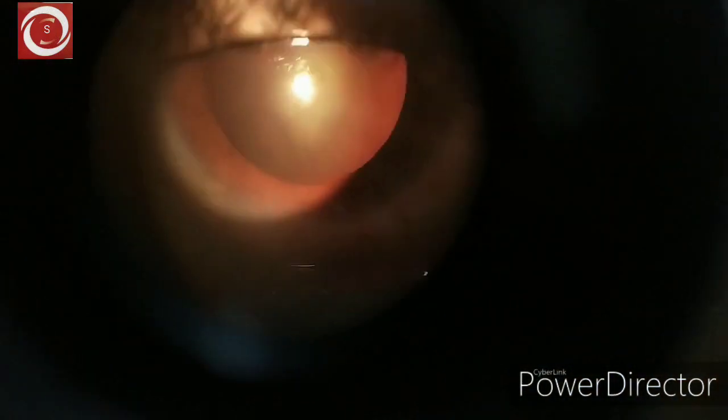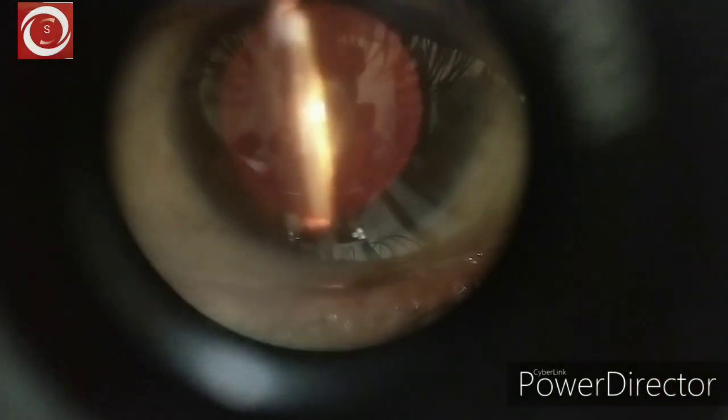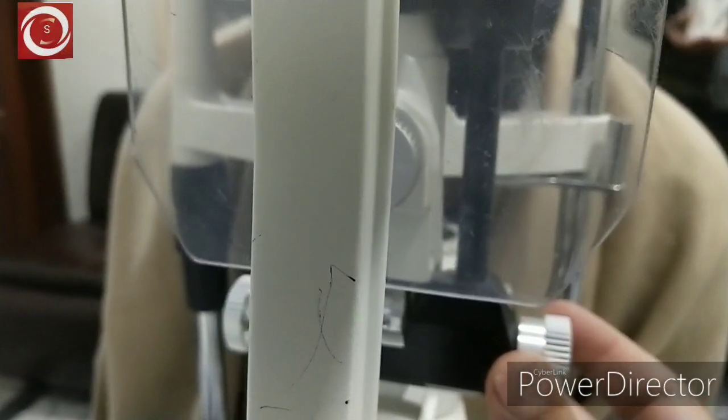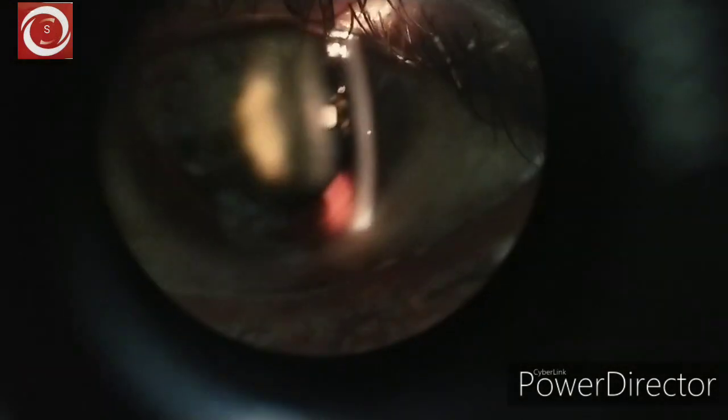Then you have to make the slit — just narrow this beam — and it will become a slit. Straight ahead is fine, but best practice is: if you are examining the left eye, keep the light on the right side, and for the right eye, keep it on that side.